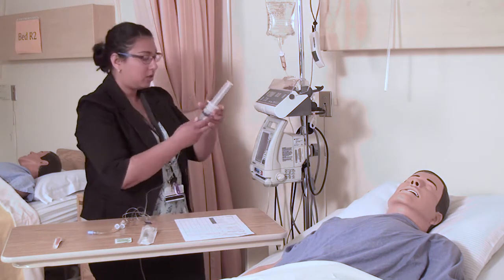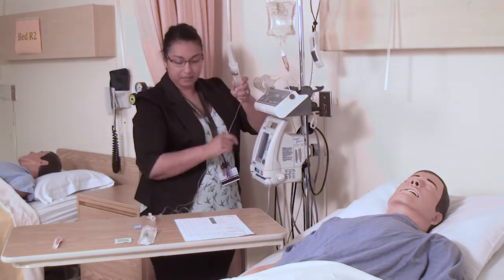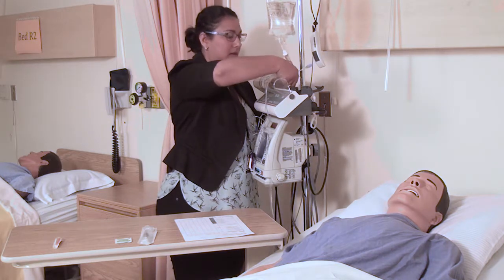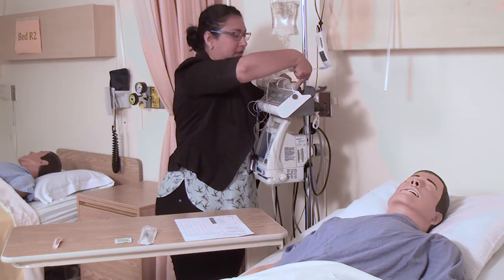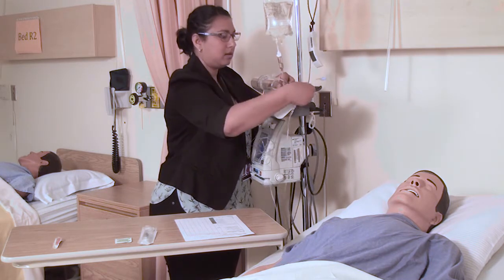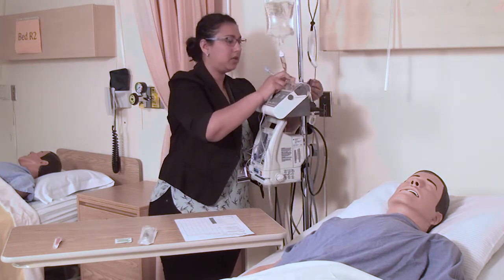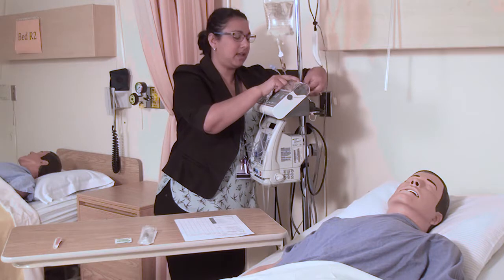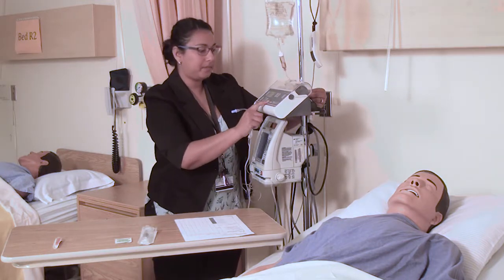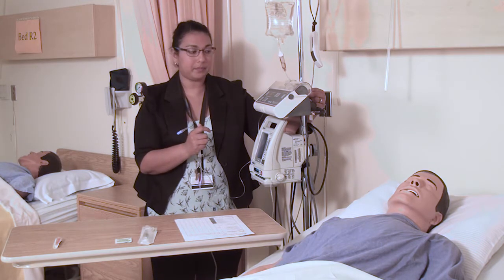Once that's done, you want to load your PCA into the pump, keeping this sterile. Now, your PCA pump is a little finicky. But once you load it in, you can lock it and turn the key so it's locked. And now we'll turn it on and start the programming.